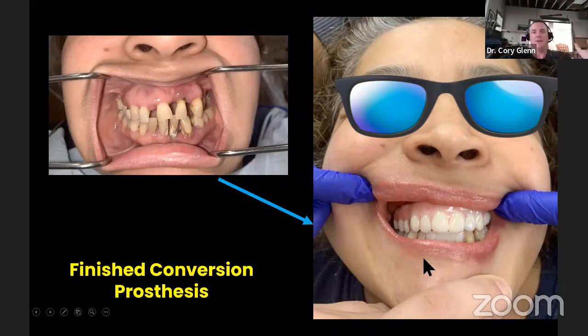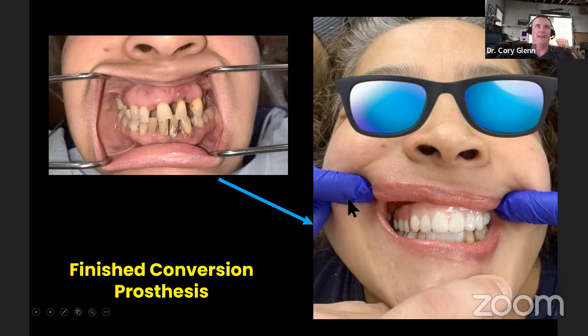So if you take away one thing from me today, well, 3 things. This auto segmentation is incredible. It's going to save you mountains of time in all your planning of any kind of bone supported case, or where you just need to use the tooth roots to create extraction sockets or whatever. Secondly, start doing 2D simulations. It's going to make a ton of money for you because you're going to sell a lot more dentistry, but it's going to make your cases more accurate by helping determine where exactly to do wax ups.